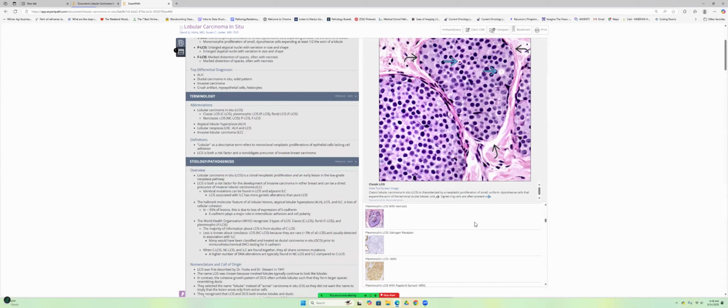Most likely it's going to be DCIS. I'm looking at LCIS now. I can't find the clinging type. I think the clinging type should be LCIS. Let's see. Hey, look at it. It looks like, let me see. LCIS with clover leaf pattern. I think this looks like a pagetoid one, I would think.